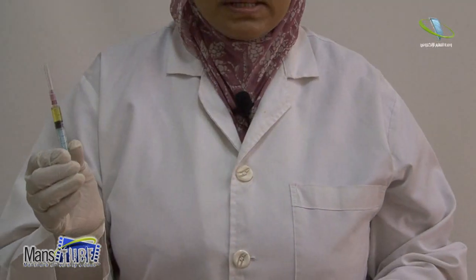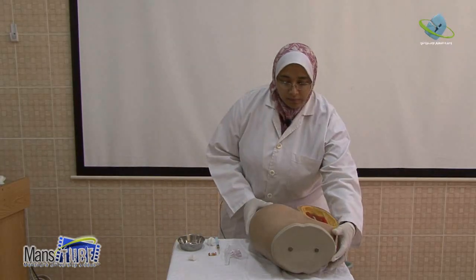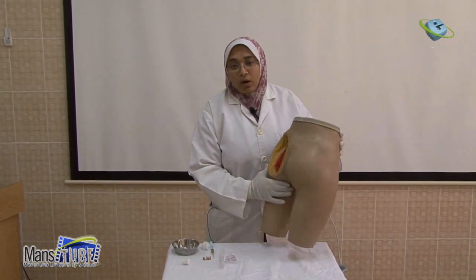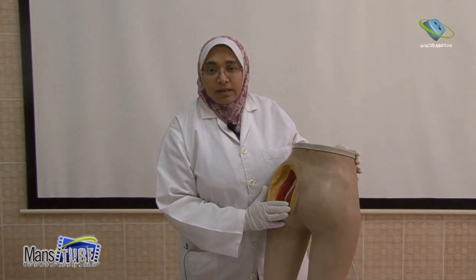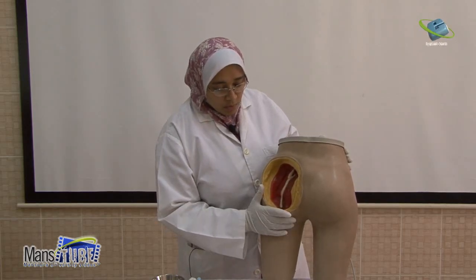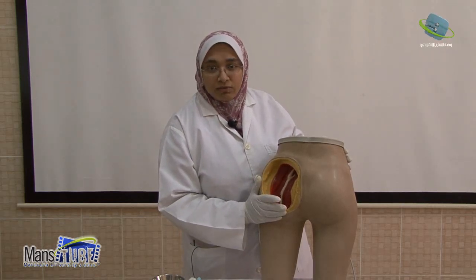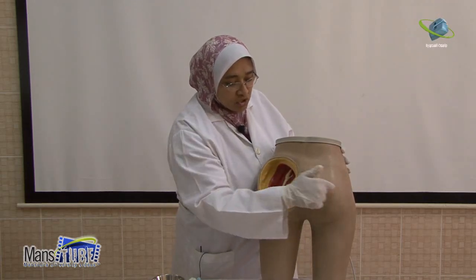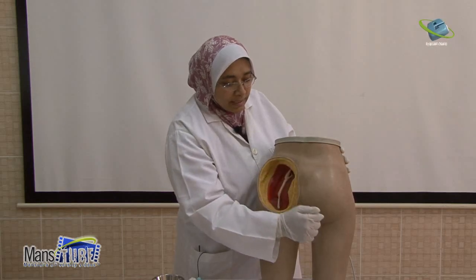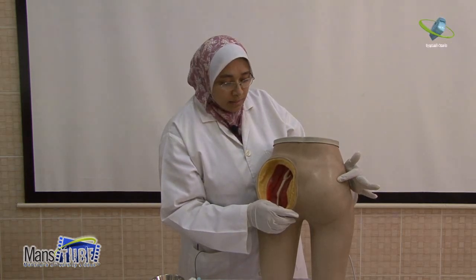The syringe is now ready. I will need one dry cotton sponge and one alcohol swab for giving this IM injection. Today we will discuss the gluteal muscle intramuscular injection site. This model shows the sciatic nerve — I want to inject away from it. I will draw imaginary lines, one horizontal and one vertical, and inject in the upper outer quadrant of the gluteal muscle.